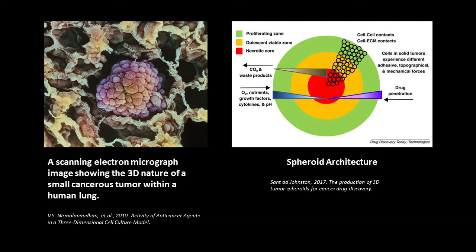They're getting more cell-to-cell interactions. When they're grown in a clump like that, you end up with these gradients where you get more oxygen or nutrients for the cells on the outside, whereas the cells in the middle of that clump are experiencing a lot less of that. And that's important because if you think of something like a solid tumor in your body, that's going to be more like that type of mass or clump, and the same thing with an organ.